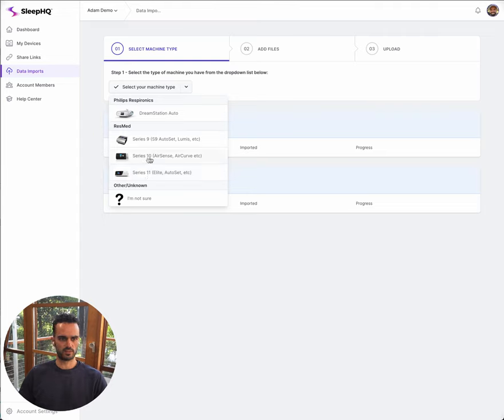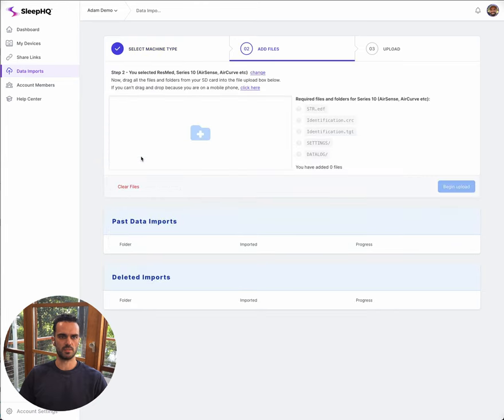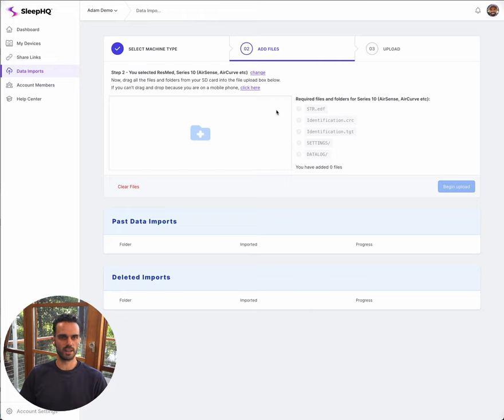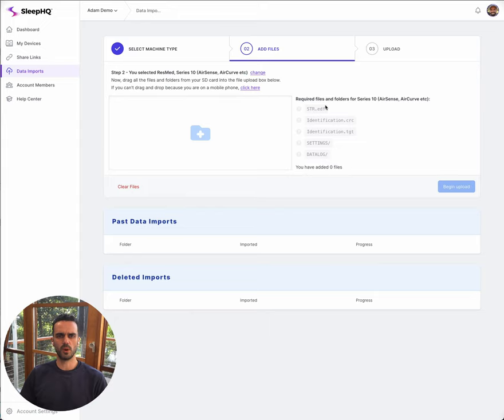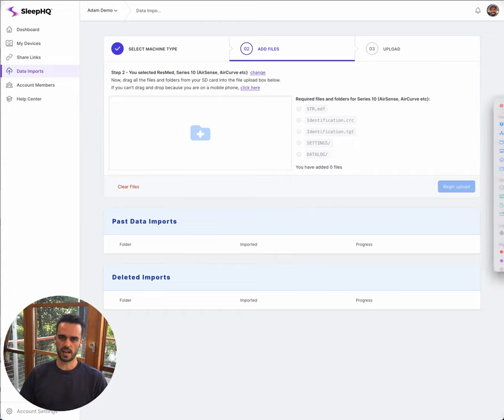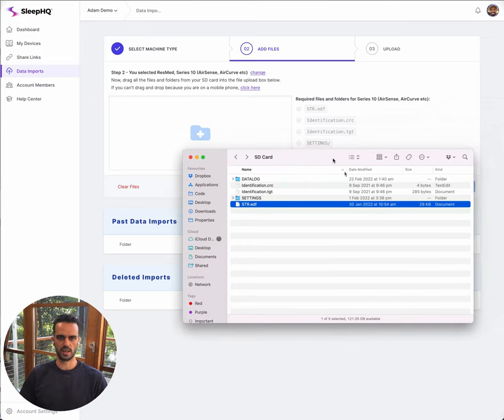I'm going to be importing data from my Series 10 machine today, so I'm going to go ahead and select that. Now it's taking me over to the file upload window. What I need to do now is insert my SD card into my computer using an SD card reader. You can buy these off eBay. Any SD card reader is going to work, just be aware that some of the cheaper ones might be a little slower. If you're uploading a lot of data, then your SD card reader actually makes a difference.